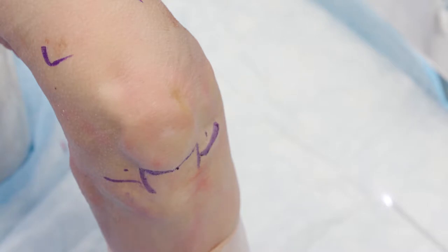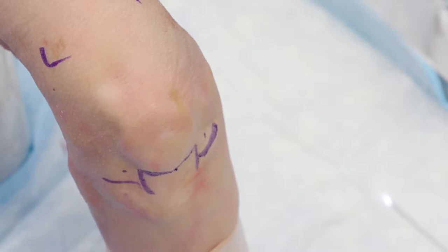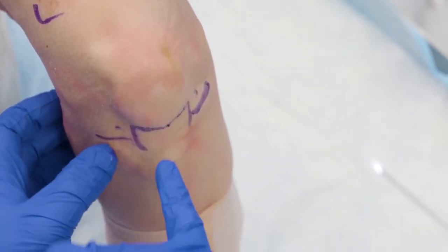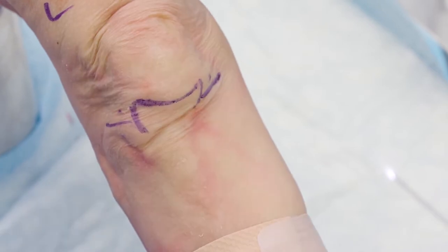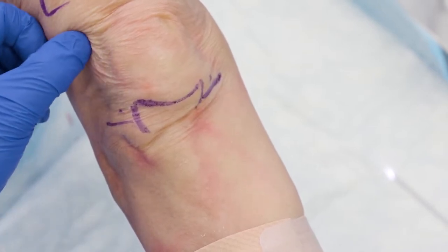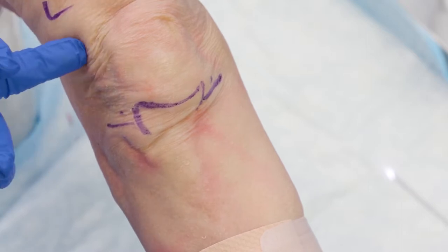When I have my patient marked out, I'll prep them sterilely. Then I'll go ahead and inject the skin wheel with about one cc of one percent lidocaine on either side. This will allow me to anesthetize the skin without inflating the fat pad. To get more anesthetic into the knee joint, I'll extend the leg and go suprapatellar on the lateral side, inject the skin wheel there as well, and then inject the remaining five to six cc's of one percent lidocaine into the joint through the suprapatellar portal.